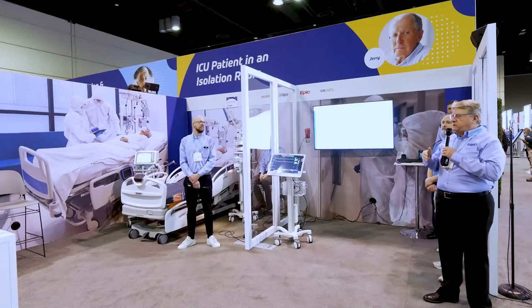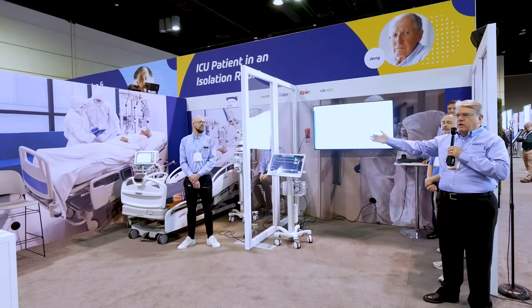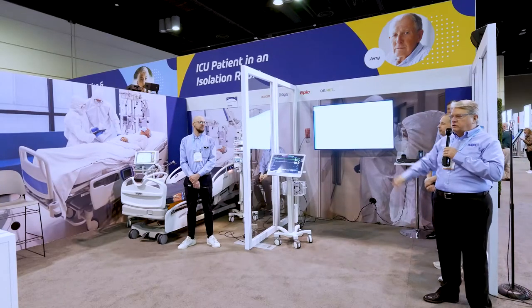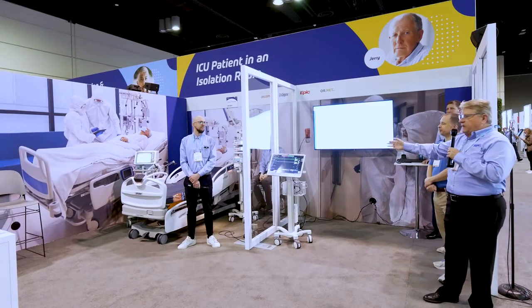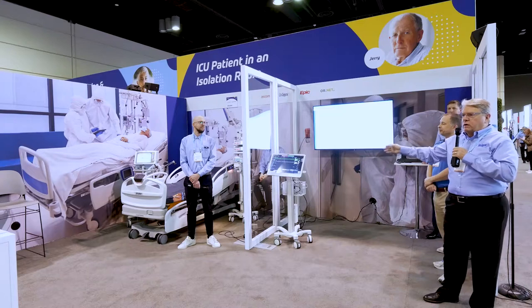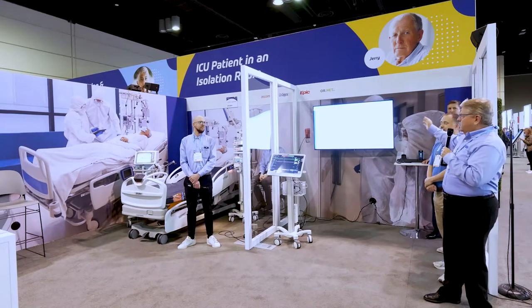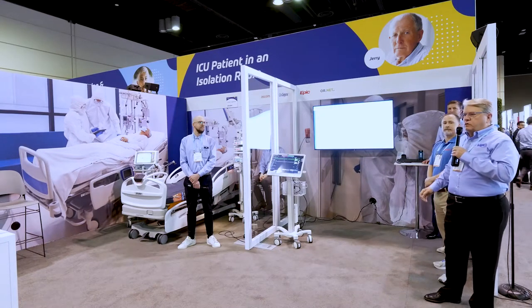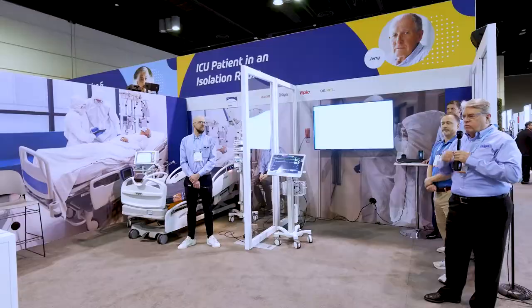To set the stage, we have our ICU isolation room, the anteroom area, and the large screen here represents the nurses' station. At this point, it is now time for Jerry's first non-invasive ventilation trial.